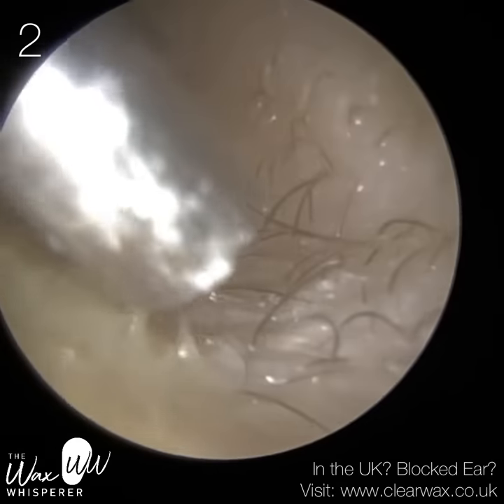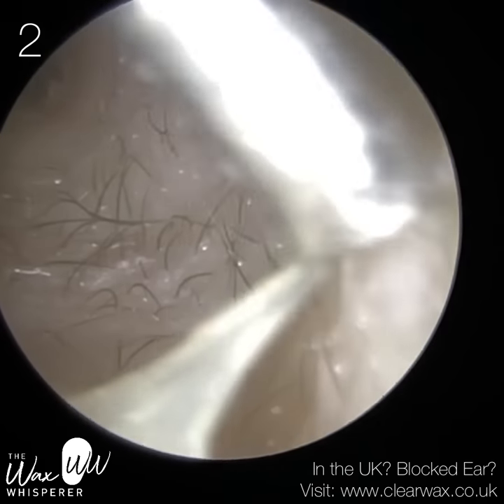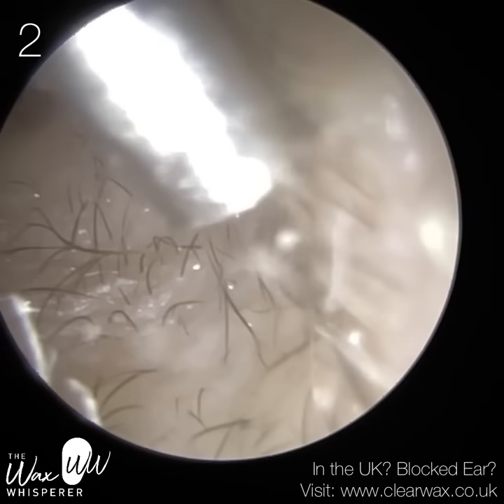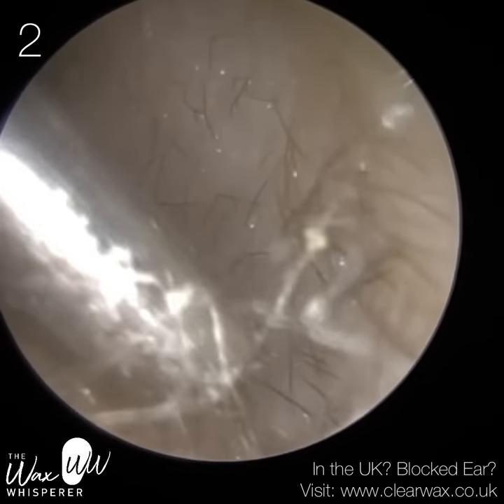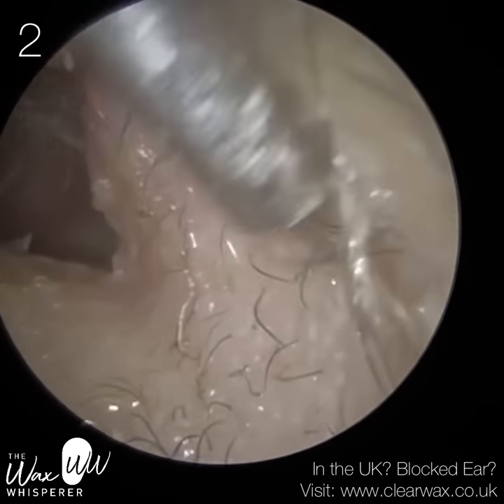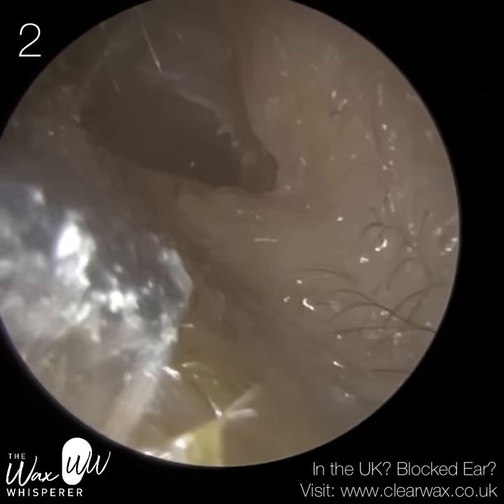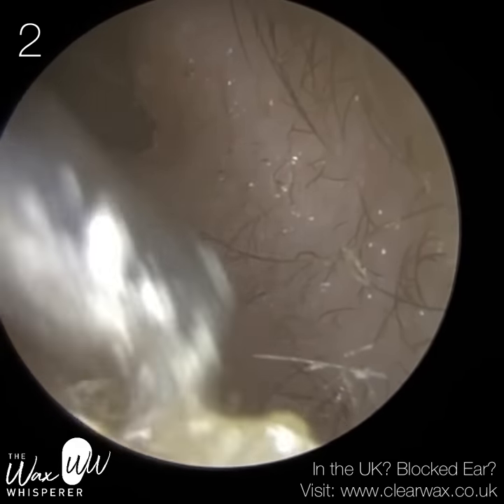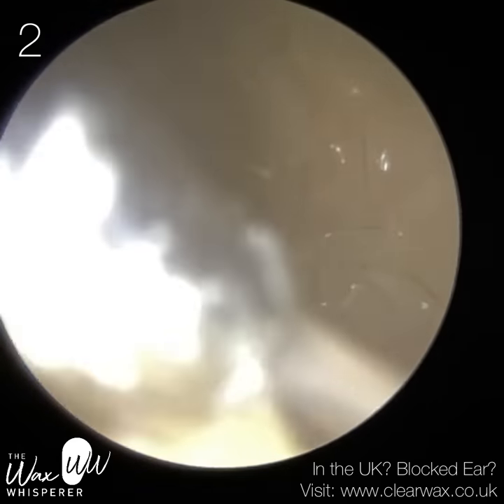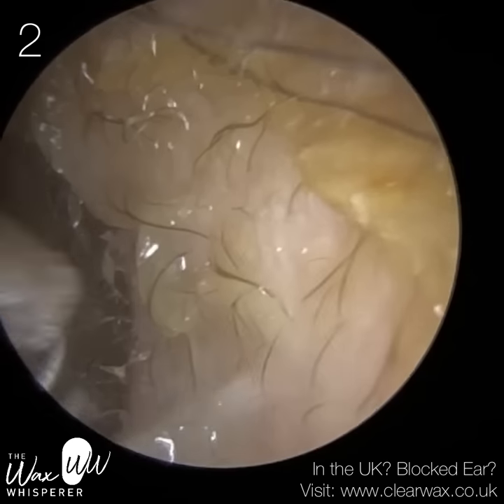After the first appointment, I also recommended nasal decongestants, which I'll explain now. All this discharge at night — when my auntie was laying in bed and tilting her head over — this pus was being ejected out of the middle ear, through the grommet, into the ear canal, and collected on a pillow, staining it every morning. Even when my auntie arrived, you could see the outside part of her ear was full of discharge and pus. She was having a tough time with this infection. This is appointment three.